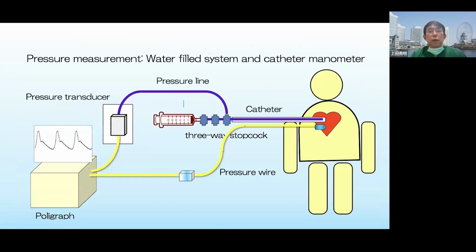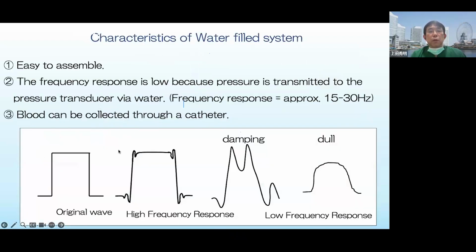So if we put the catheters inside and then fill with water, we will be able to measure it using the pressure transducers. But still, we have to evaluate whether the pressure is adequate or not, because if it is fully water, it should sharply show the pressure.